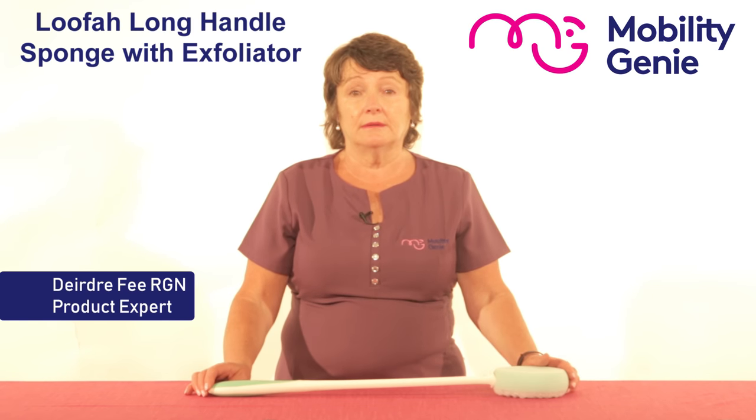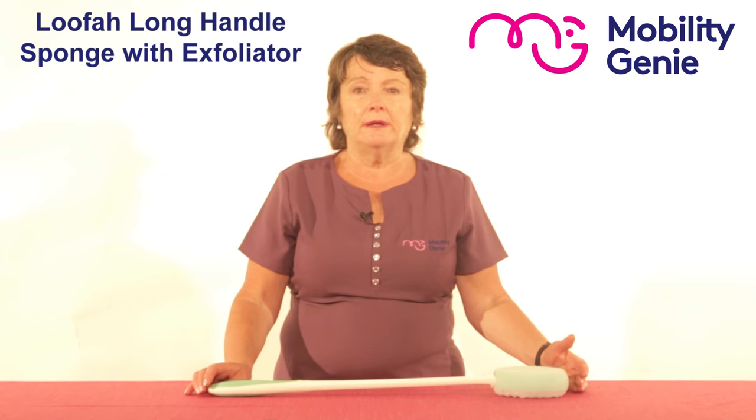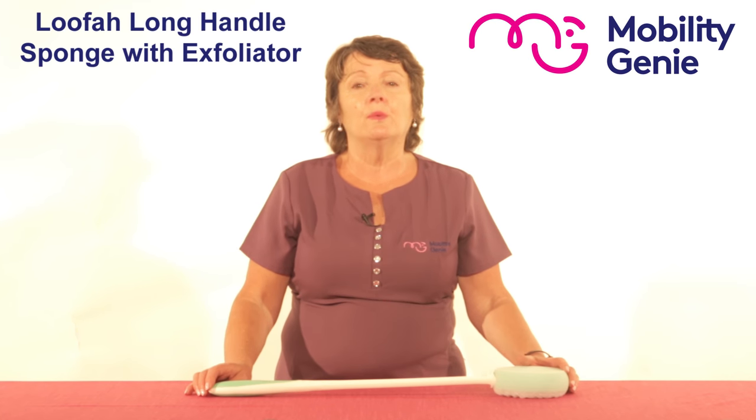Deirdre from Mobility Genie. At Mobility Genie we recommend this Lofa long handled sponge with exfoliator.